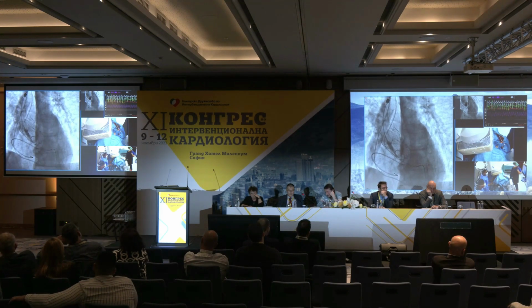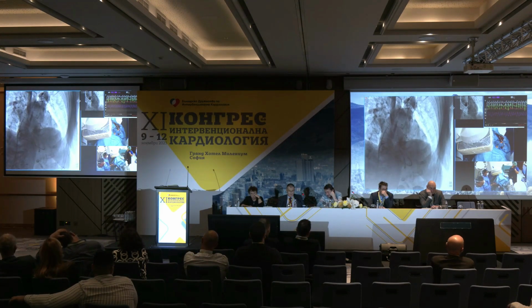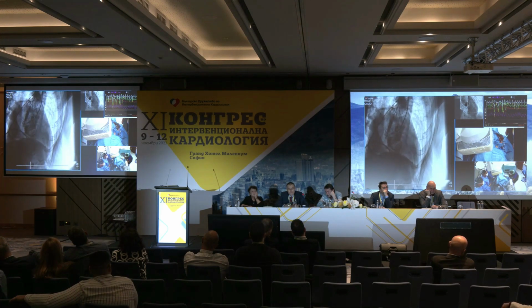because the lady is very, very small, and even from the axillary artery, the distance to the valve is very, very small. And because of that, very carefully we removed the nose of the delivery system. And this is the first check in this position, into the left position. You see it's virtually zero PVL. Next, and we checked also in the other position, the right. And again, we have zero PVL.